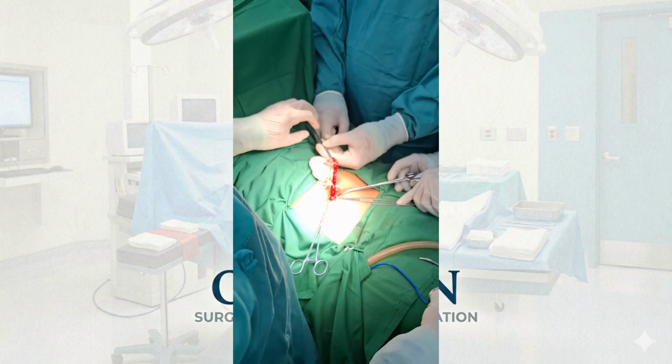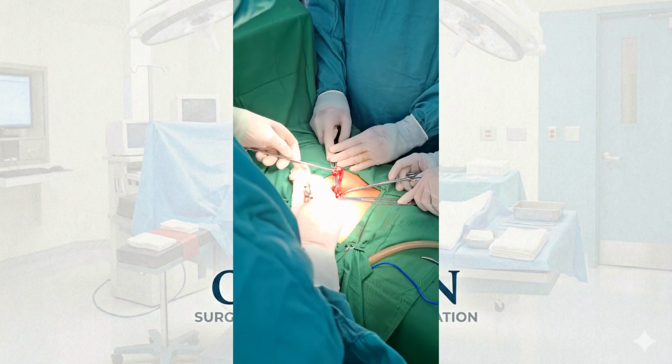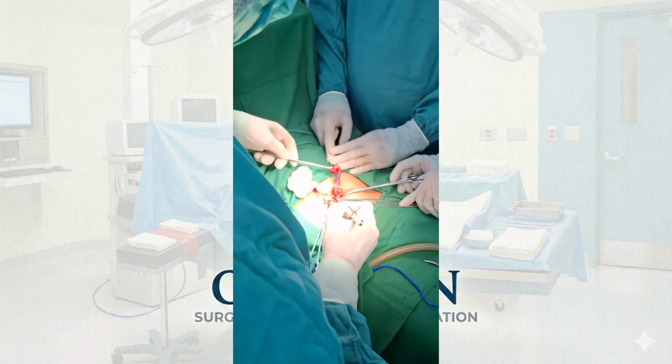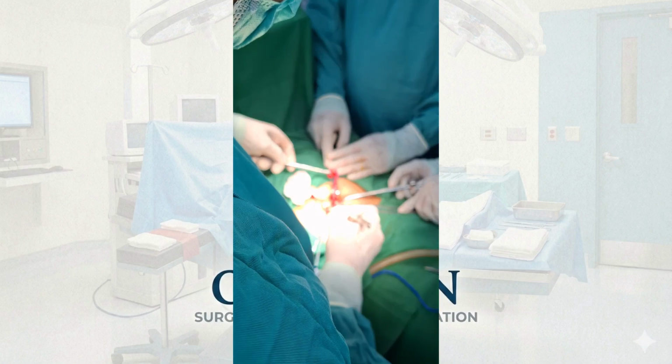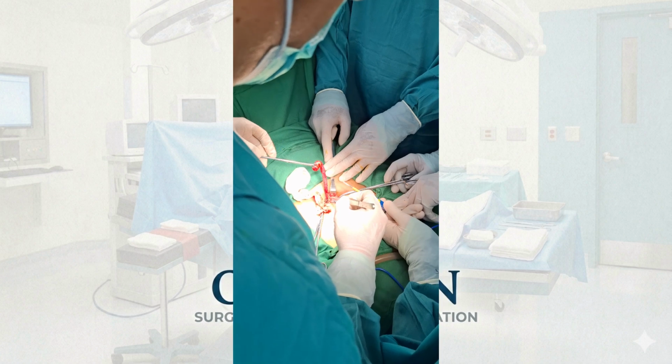We begin with a precise incision to access the peritoneal cavity. Notice how the surgeon carefully dissects the surrounding tissue to isolate the inflamed appendix. Maintaining a clear surgical field is crucial to avoid any complications.